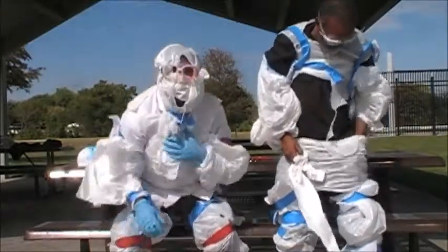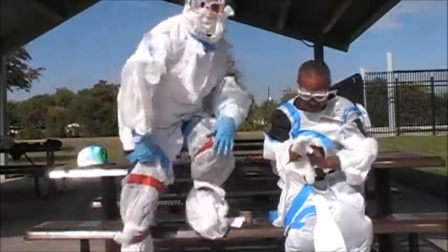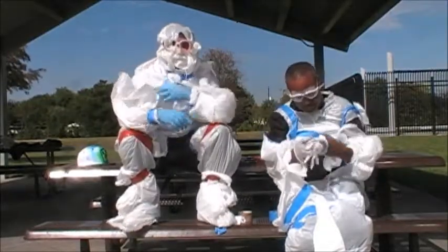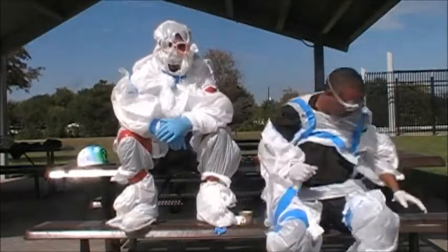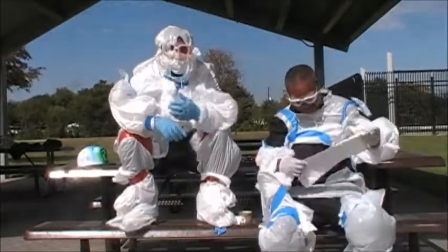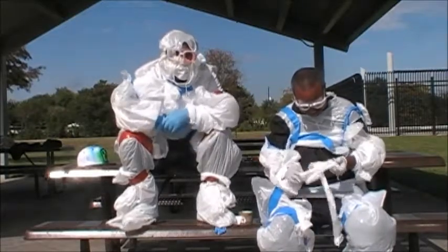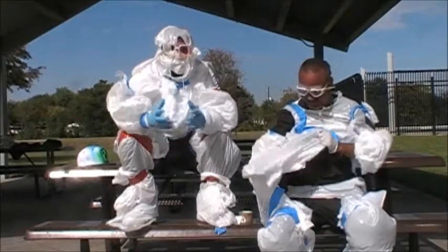There you have it — the bowler suit for dummies. This is Raimondo and another episode. Keep yourself protected by all means necessary for low budget, ghetto, household appliances. This is the ghetto Ebola suit, the version of it.